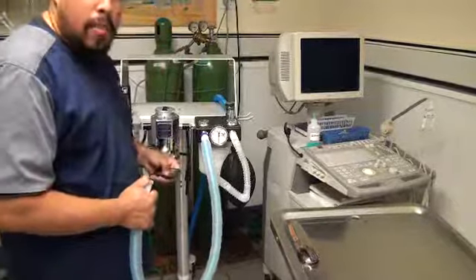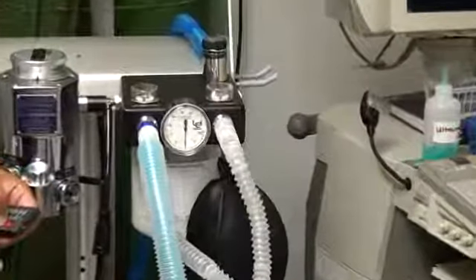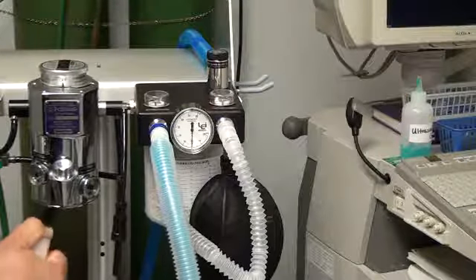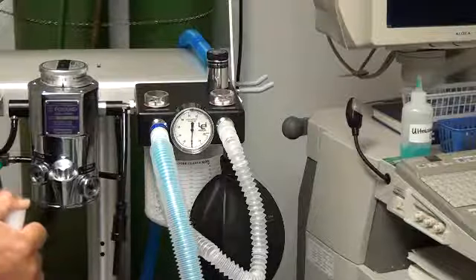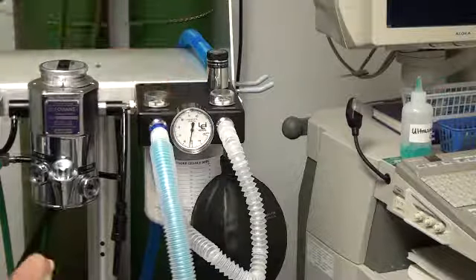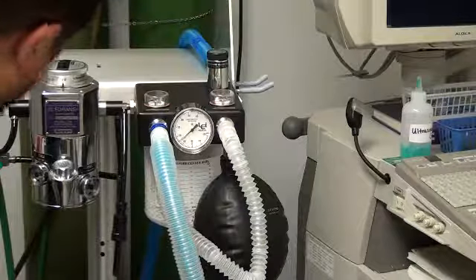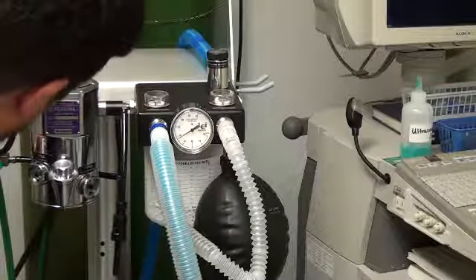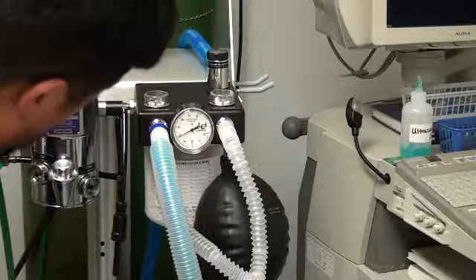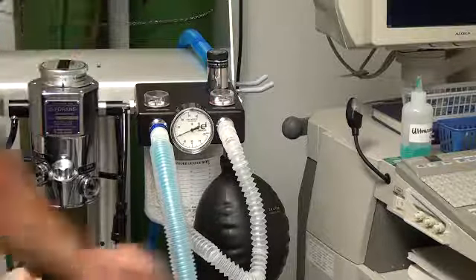Going to zoom in on the manometer. As soon as we start to see the manometer rise, when the needle reaches 20 centimeters of water in pressure, I will reduce the flow from 2 liters per minute to 200 milliliters per minute. Okay. And there, now 200 milliliters per minute.